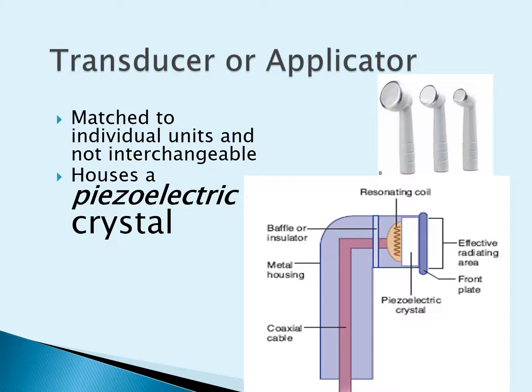It does house a piezoelectric crystal, which is what I talked about, right? I've repeated piezoelectric crystal multiple times. I think that might be important when it comes to your quizzes and your tests. So it is a piezoelectric crystal, which will transmit the sound waves into the human body.